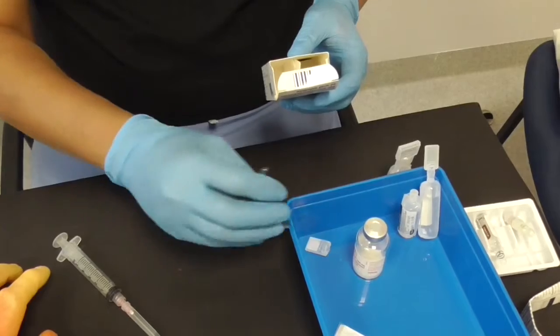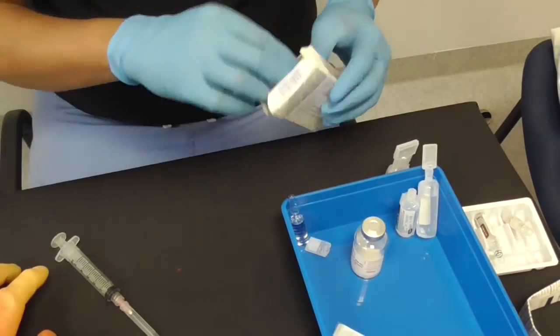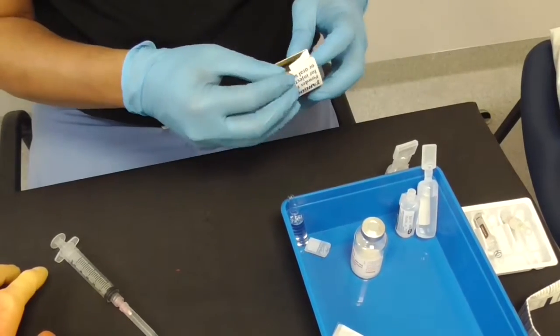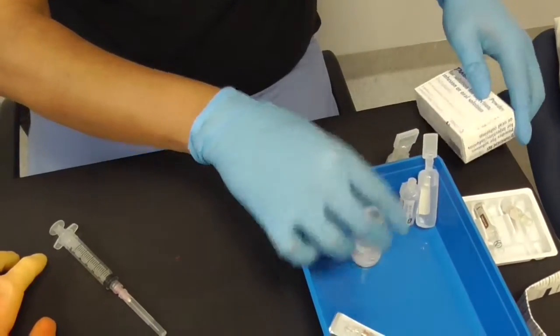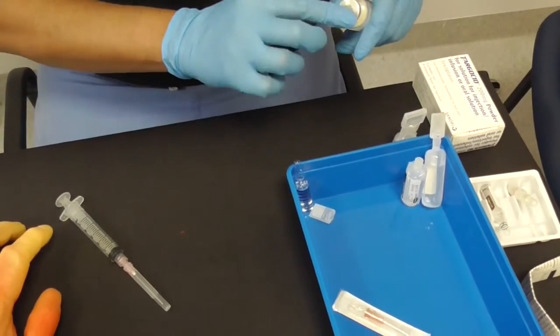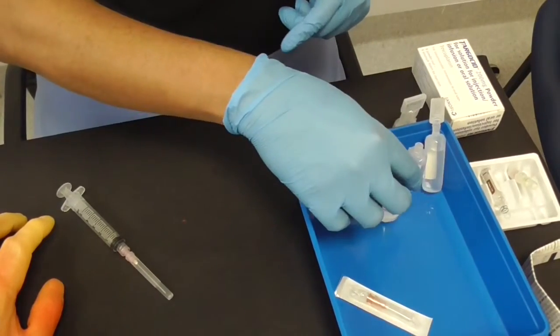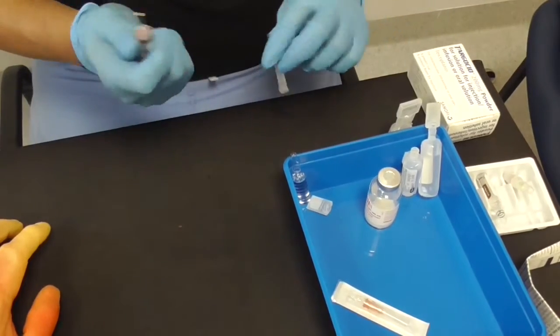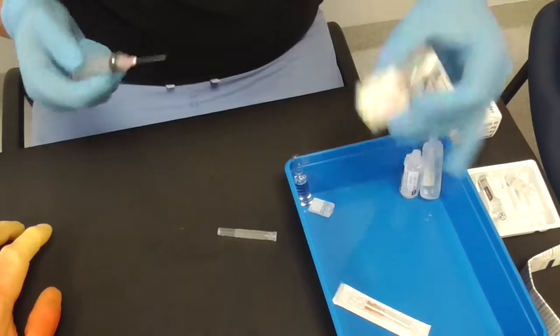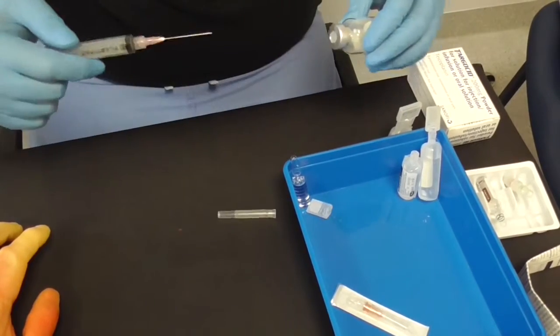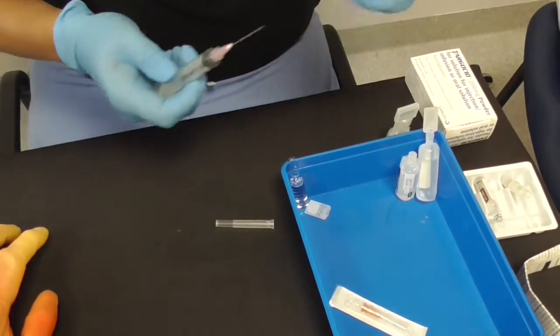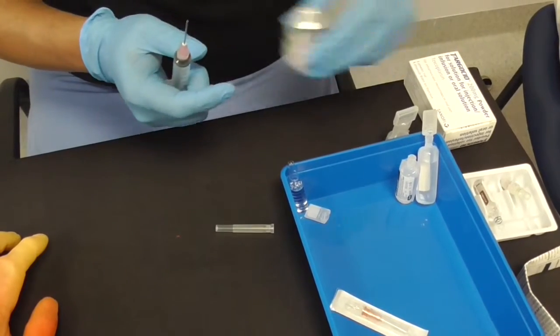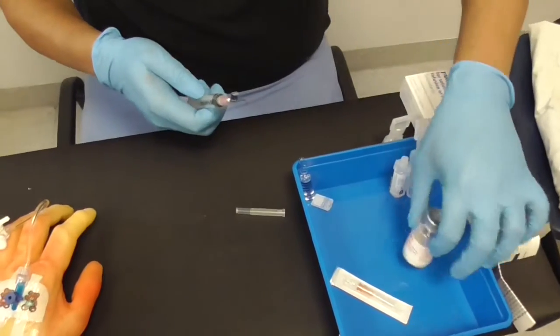Some of them actually come with their own little diluent and solution, which is fine. Some you'll have to get the generic water for injection or saline. When you take the cap off, you may want to wipe the top with an alcohol swab just to clean it. You can then use the drawing up needle, which I won't put inside because that will waste the injection. You just put it inside there with the fluid, shake it up or swirl it around, get it into a liquid form, make sure it's nicely good, and then you draw it up.